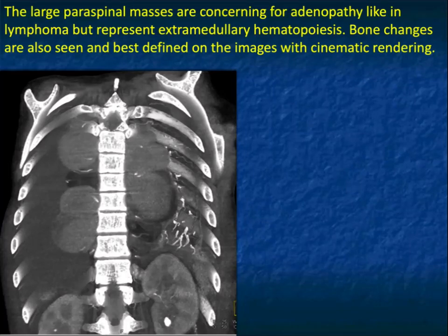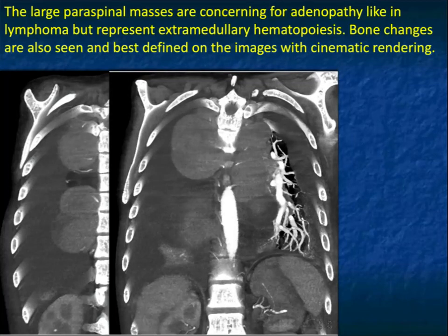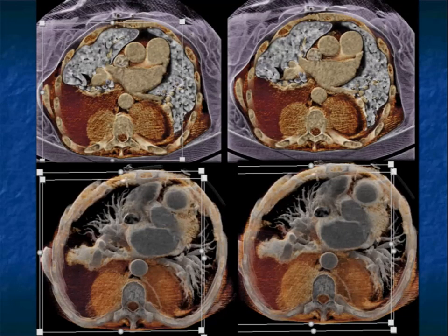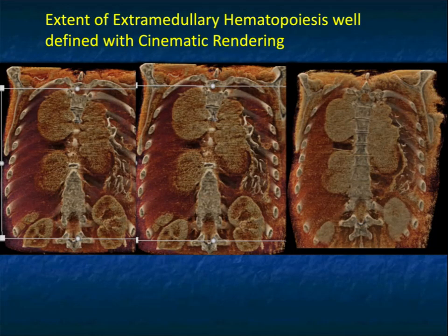These masses can be very large. This case was initially thought to be lymphoma. People will go through lymphoma, neurogenic tumors, and metastasis — all reasonable. One thing you notice, especially in the last set of images, is something abnormal with the bone — that could be myelofibrosis or thalassemia. With cinematic rendering, the large paraspinal masses are beautifully shown, and the large lobular masses pushing against the bone have attenuation very similar to the kidneys when looking at texture mapping.